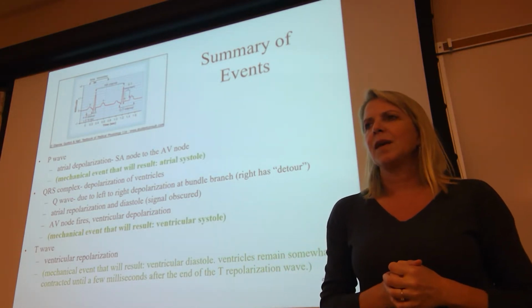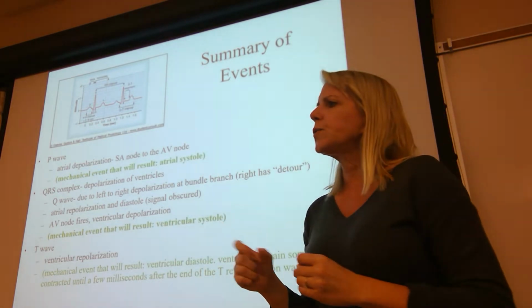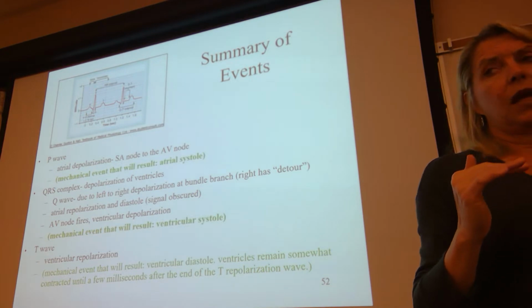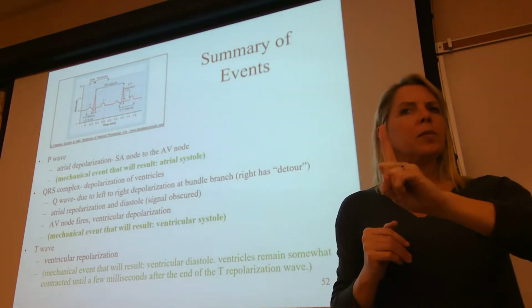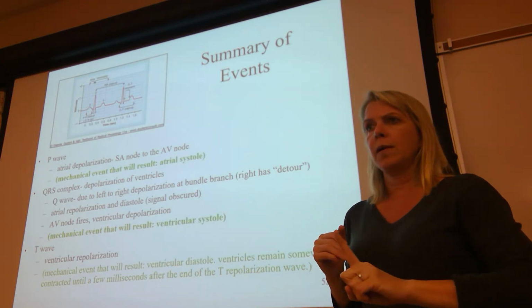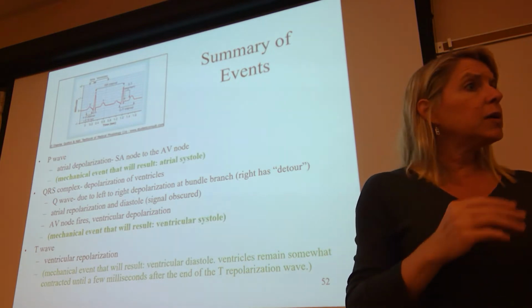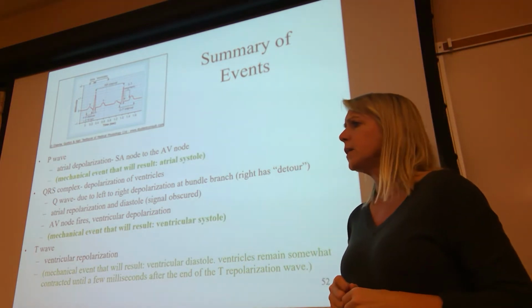Yes. You do not need to memorize the normal values for these times. You do not need to, except for one, and I'll point out the one we want you to be mindful of and remember. But all the others, normal values, are given to you in your lab manual in this table that I'm speaking of. You do not need to commit those to memory.